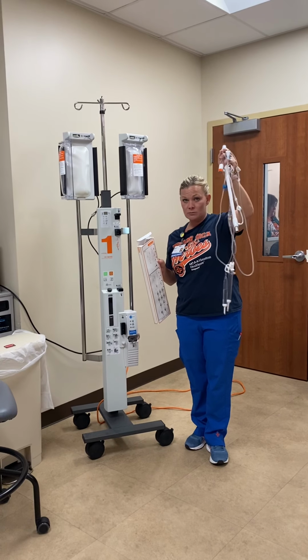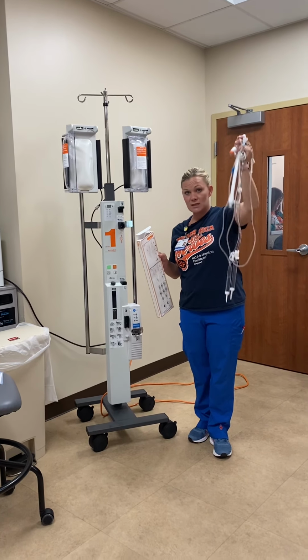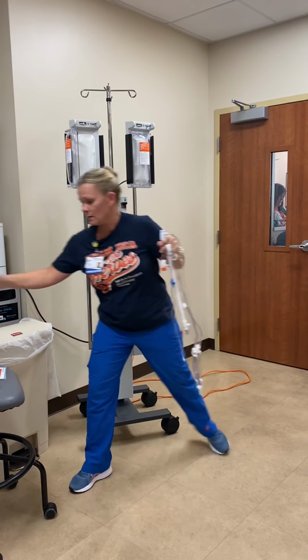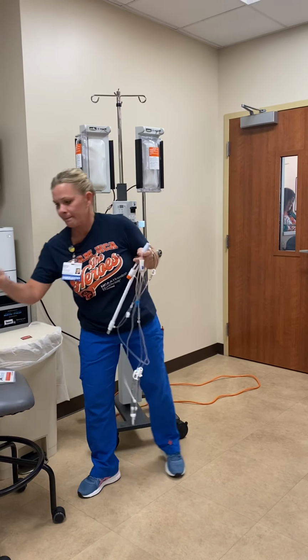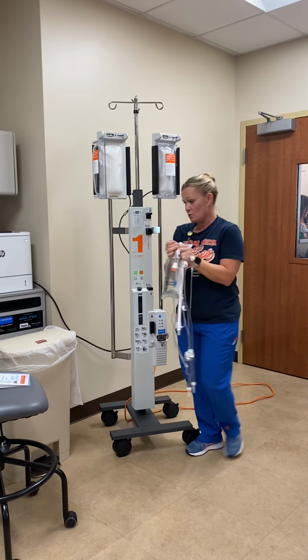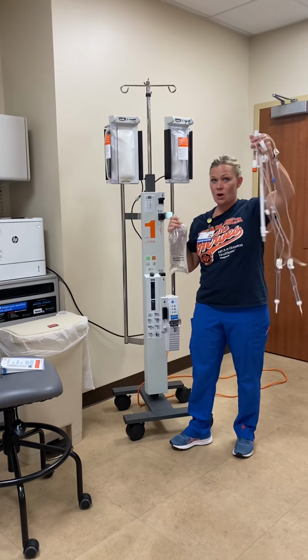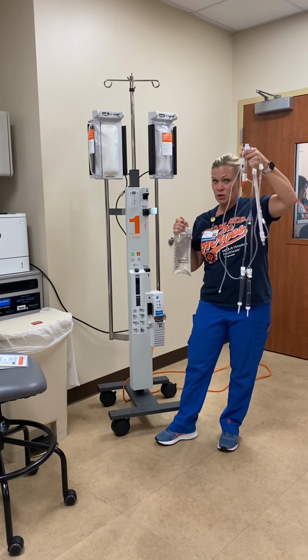I've already primed this one, but I'll walk through the steps real quick on how to get all the bubbles out for you. This is what comes out of this box. Make sure you select the right fluids that your physician has ordered for your patient. And if it's blood, again, this is the only tubing you use. You don't use blood tubing, you use this.